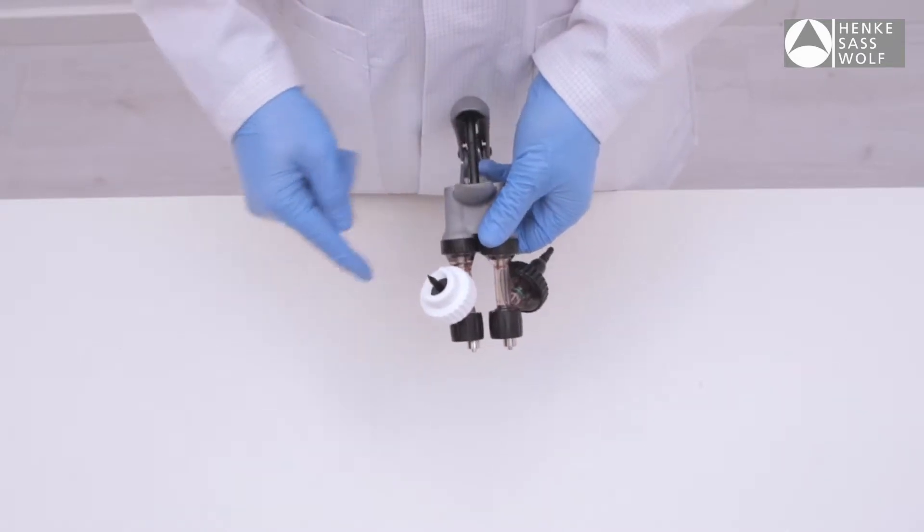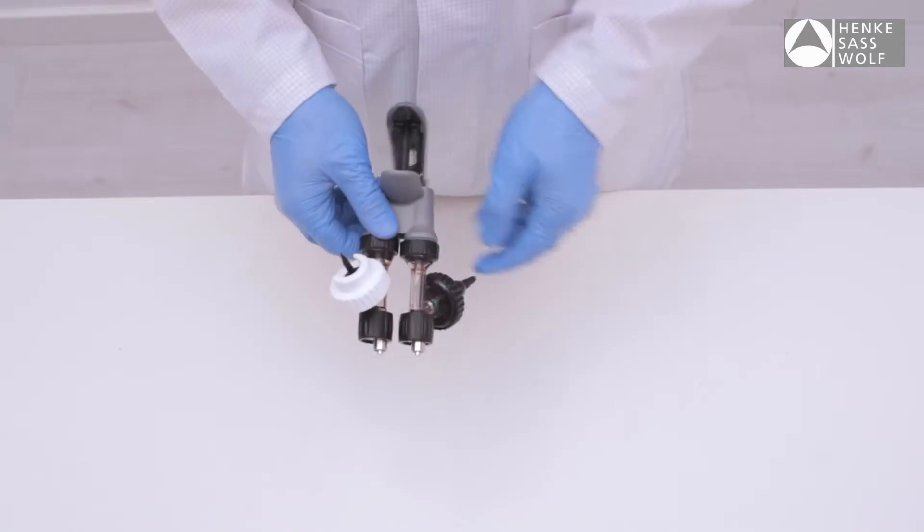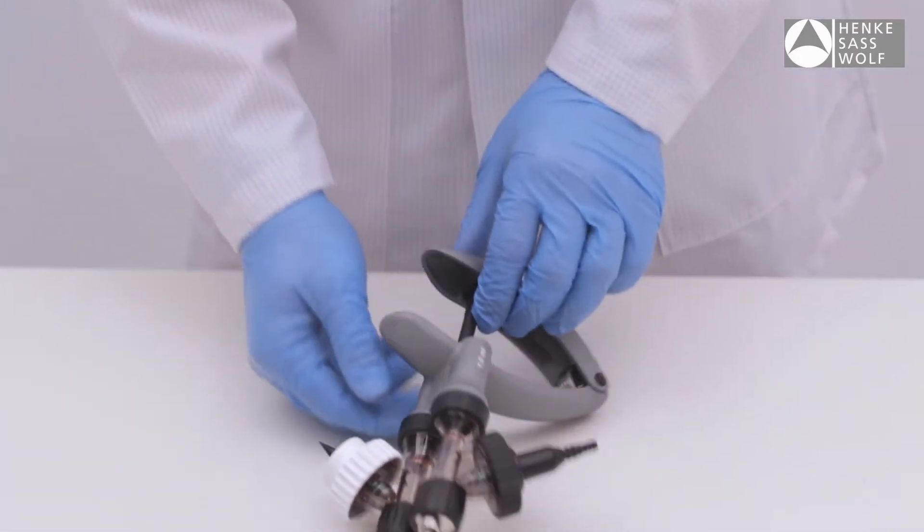Important! When using the syringe as a bottle mount, the spike and bottle must always face upwards. With a draw-off setup, the tubing collar can be upward or downward facing.